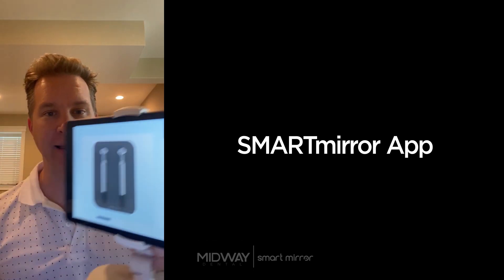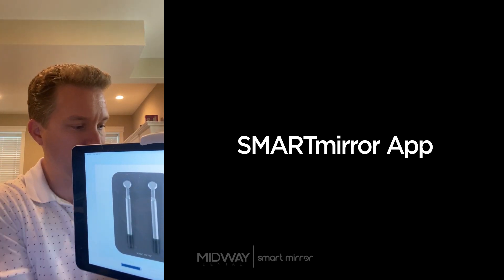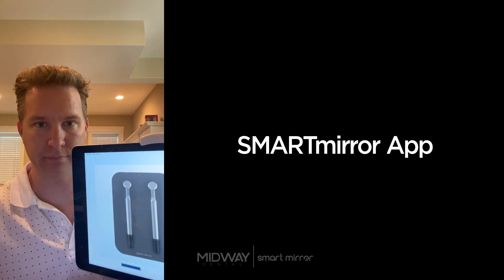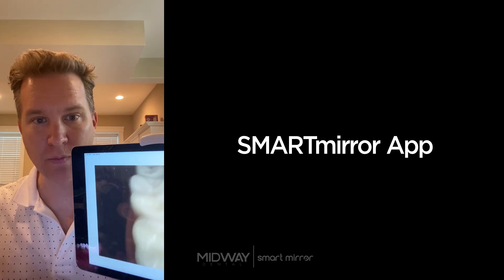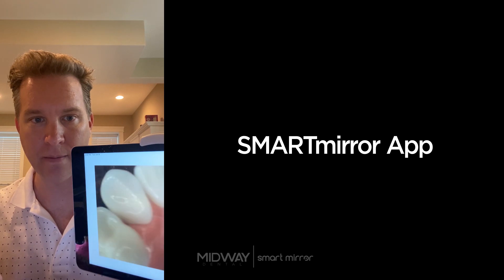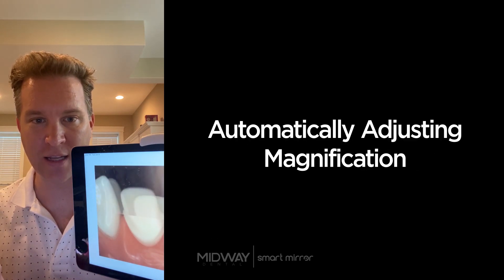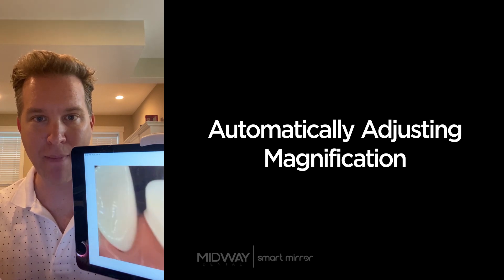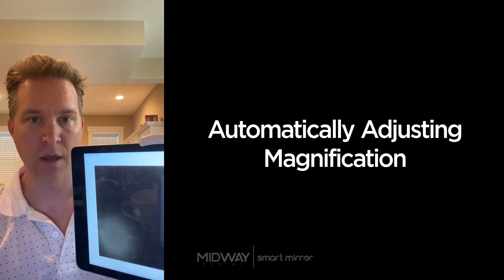It runs off an iPad, and we'll do a quick demo so you can see what it looks like. With the dental mirror in the patient's mouth, it streams live just like this. The closer you get to the tooth surface, the more magnification you get; the further away, the less. It can magnify up to about 15x — it works somewhat like a microscope. That's the SmartMirror technology itself.